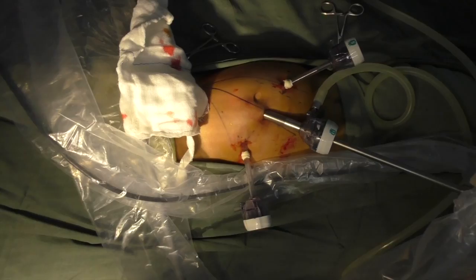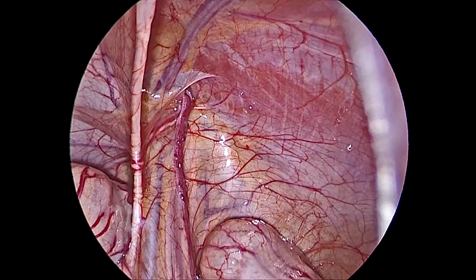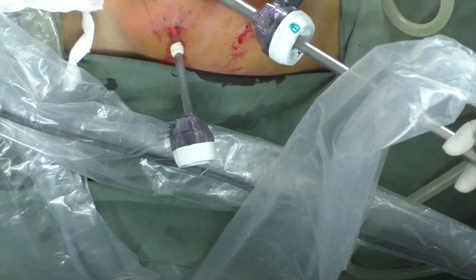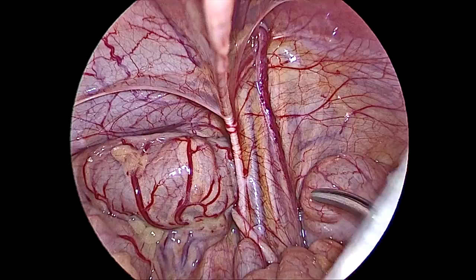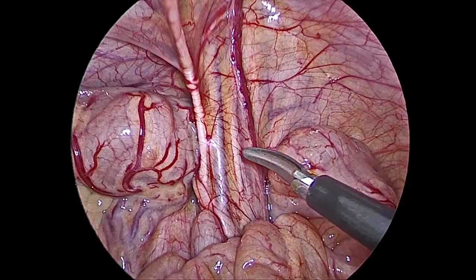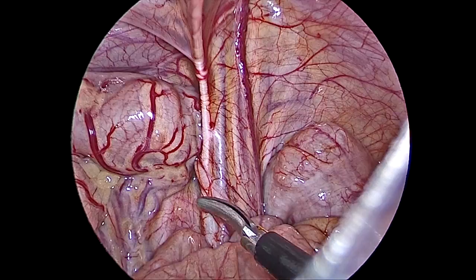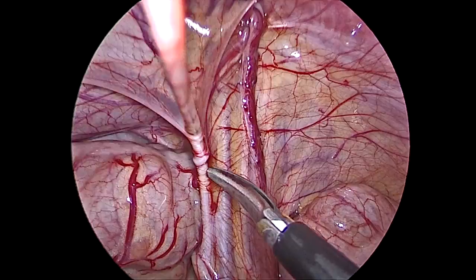These are the port positions. The camera is reversed because this is 30 degrees, so that you can see the inferior epigastric artery, obliterated umbilical artery, and deep inguinal ring. Now we will take right hand scissors and left hand Maryland forceps — this is our standard instrument combination. The left hand uses the Maryland because it has precision. You can see the ureter, the sigmoid colon, the external iliac vein, the vas, and the obliterated umbilical ligament.